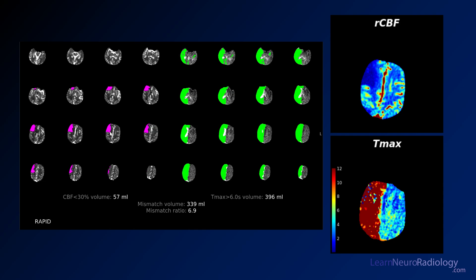And so it's in that area where we saw hypodensity on CT. But if we look at the T-max, it's detecting a much larger area of elevated T-max, so there's a much larger area of tissue at risk.